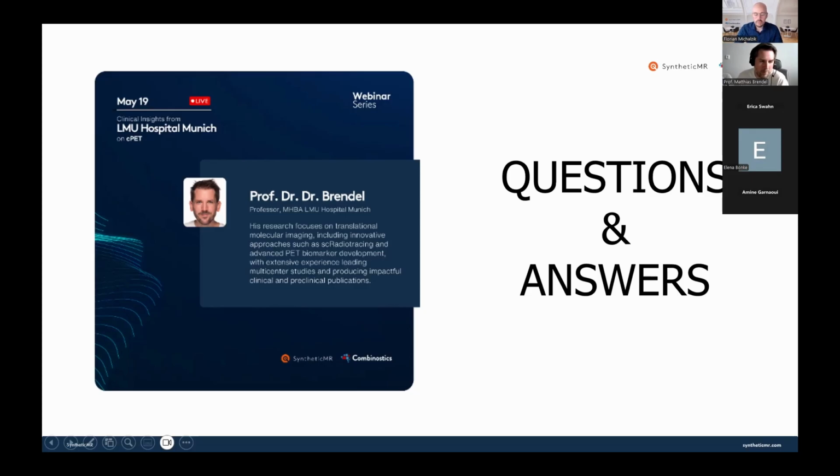So if you do an amyloid PET scan after 12 months, and you can save 6 months of therapy, then this is already clearly overcoming the cost of the amyloid PET. Even if you only find 30-40% of cases that are already amyloid negative, you will even go on the positive cost side. So I think that is a very clear and very useful tool to even save money in economy systems. Thank you very much.